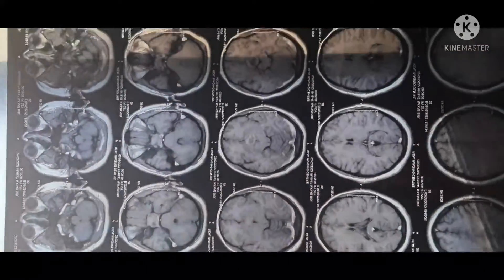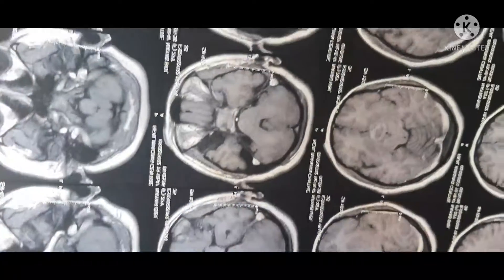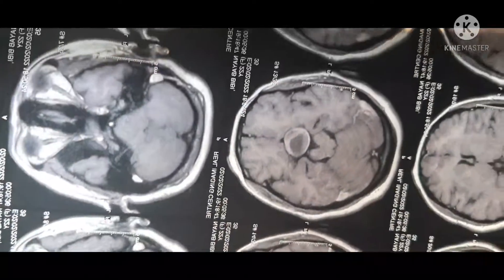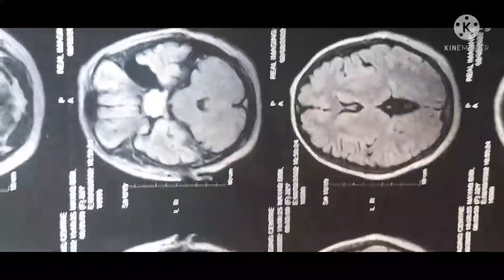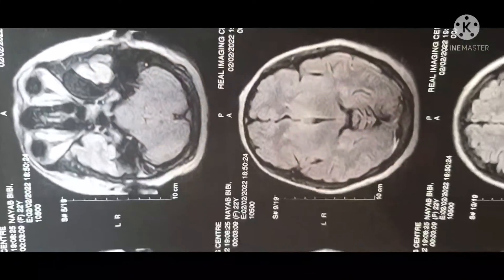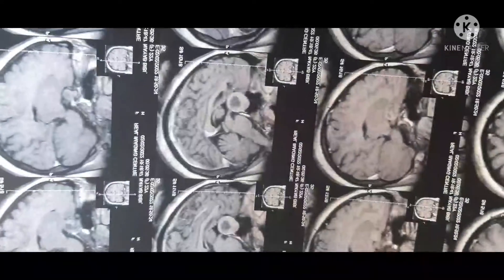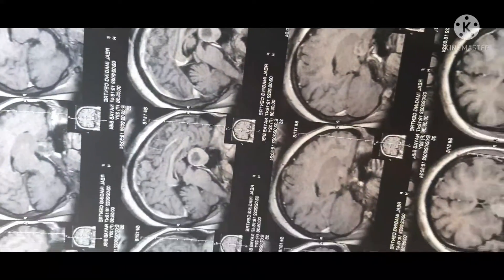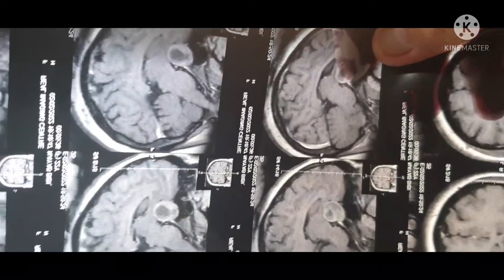This is the patient we operated yesterday. This is the MRI showing a sellar area lesion. This is a T1 — there is some cystic component as well as some solid component. This is the tentorium. The lesion has suprasellar extension, and the same is seen in the sphenoid sinus. We trans-sphenoidally resected it.